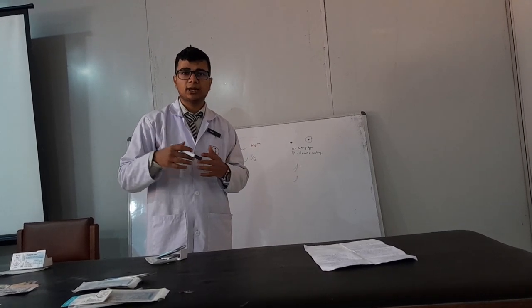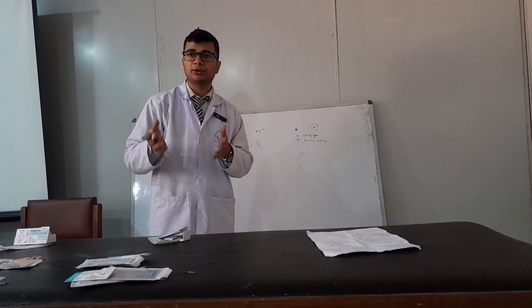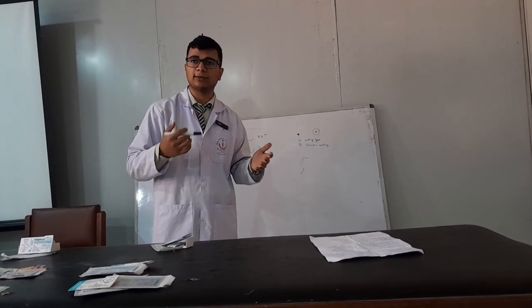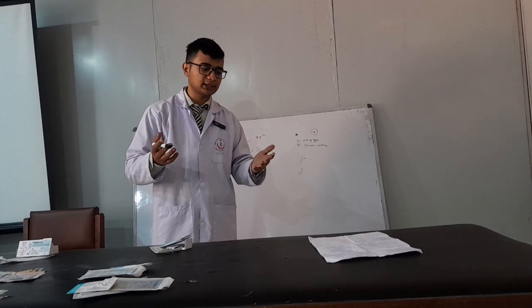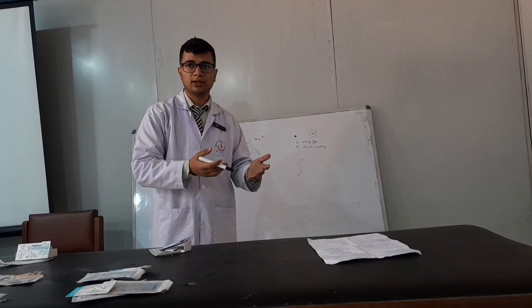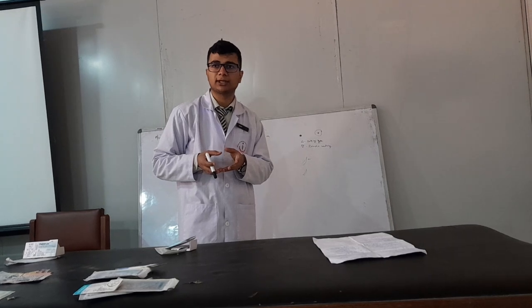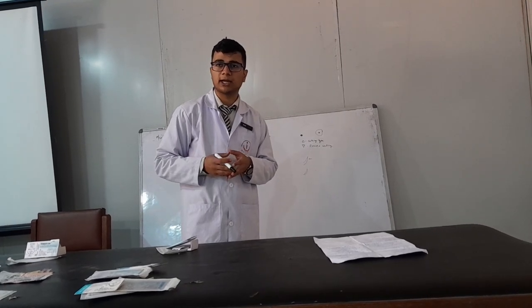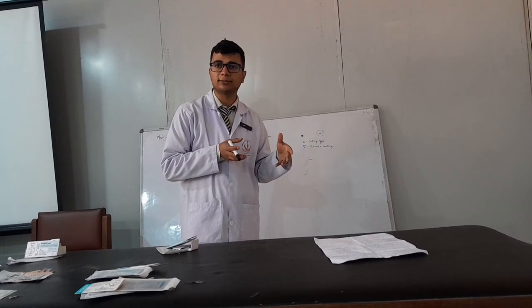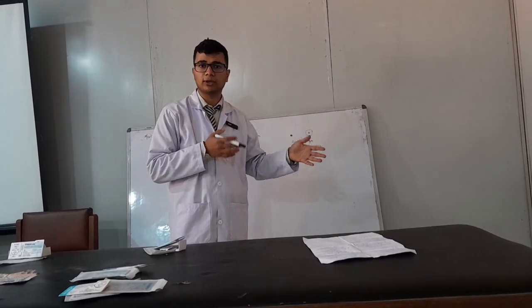But on the skin surface, you can use non-absorbable suture, because the patient is hospitalized, so the medical team will be present every time. Or suppose we did a graft transfer or a flap transfer. Suppose there is a non-healing diabetic ulcer on the diabetic foot, and I did a gastrocnemius pedicle transfer. In that case I need to use non-absorbable suture. You will be in hospital yourself, and after 5 to 10 days I will remove the suture. So this is one category: absorbable and non-absorbable suture.